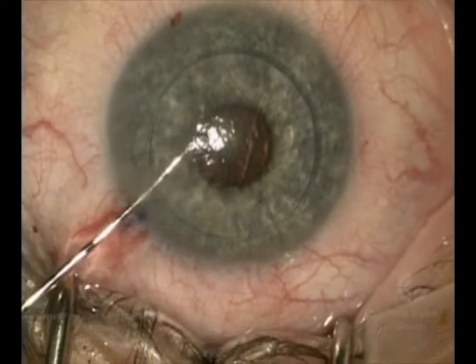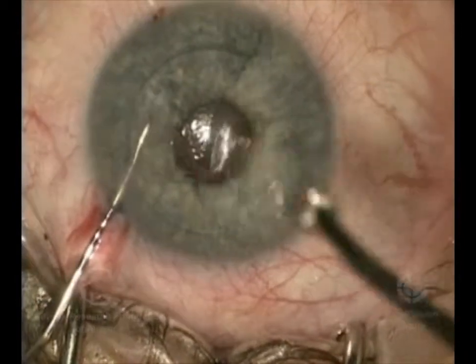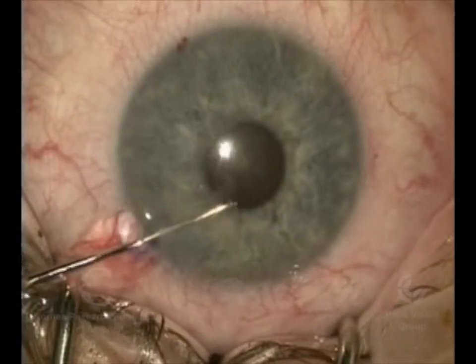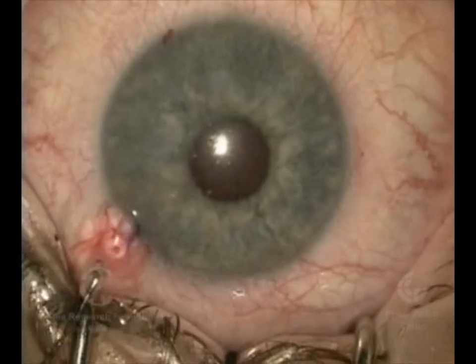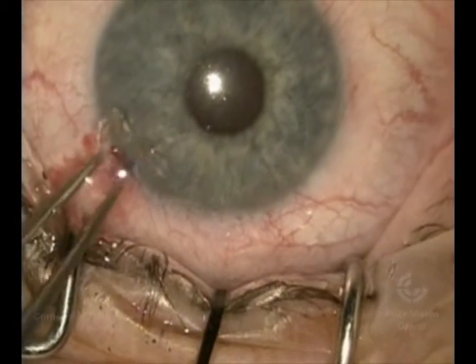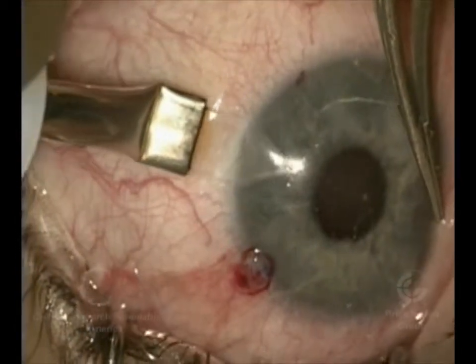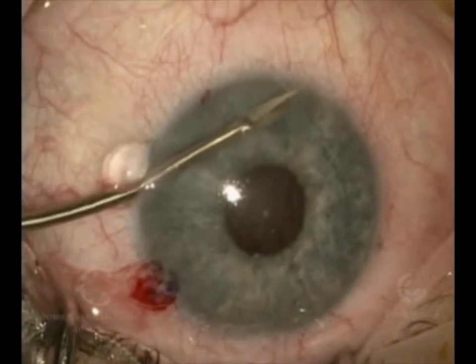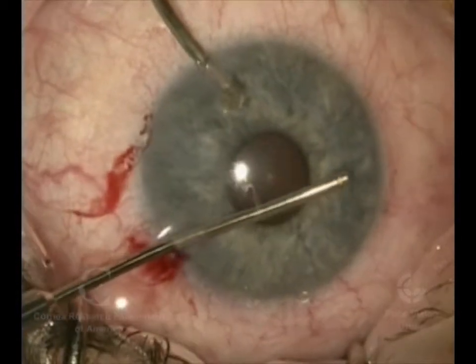And then after we do that, we will go back into the eye and actually make a hole in the iris — the colored part of the eye — to prevent what we call pupillary block or air block from the air we put in at the end of the case. Here we're making the main incision to put the donor in later, and now we're making the hole in the colored part of the eye.